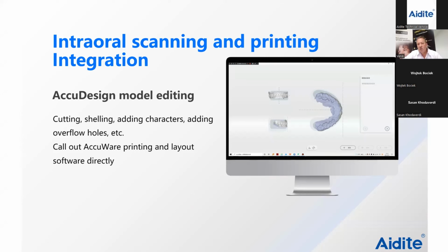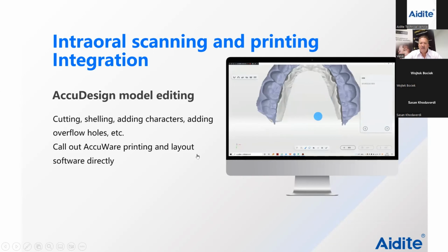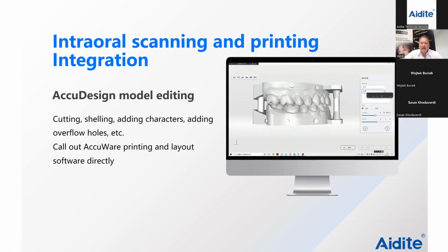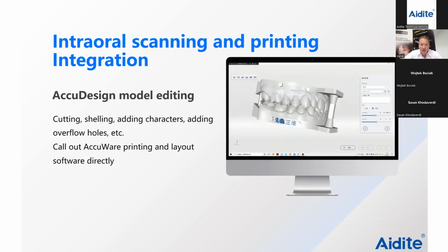This is for dentists who want to maybe print a quick model in the dental office, but in the laboratory, we are not really interested in this because we import it to Exocad, and then in Exocad, we do our crown, and then we design our articulator on it, and then we print the model. So it's a nice gimmick to have, but we don't really need this. It's very simple to design your model with the scanner, easy. But we also have to do the crown. It's built in, it's there. If you want to do it, you can do it.